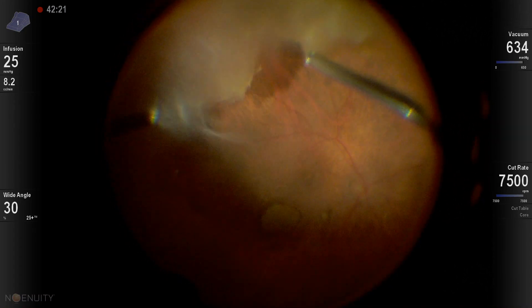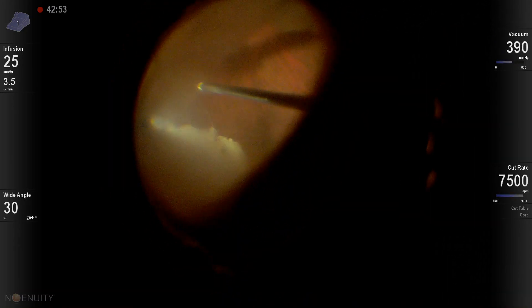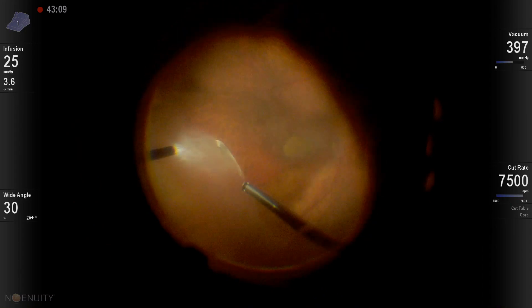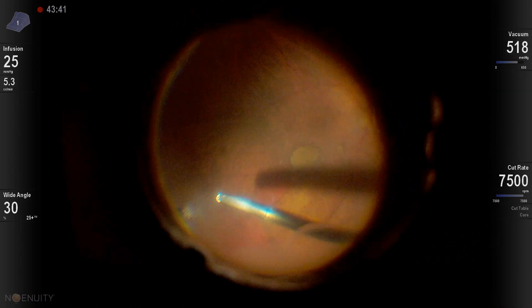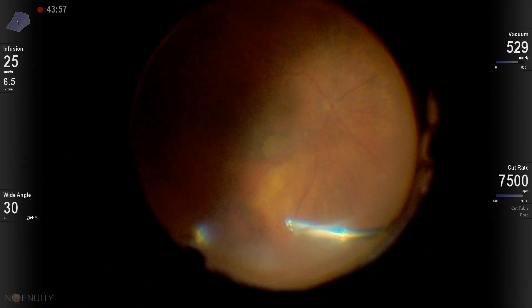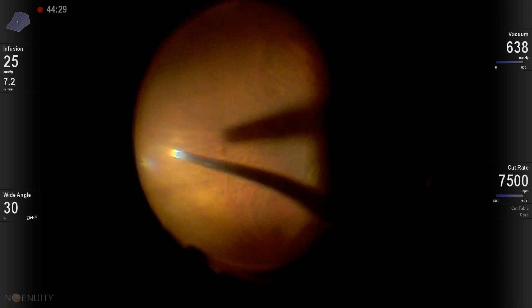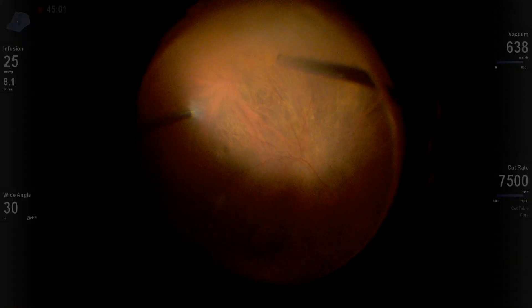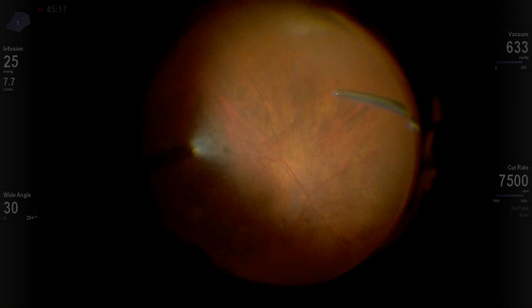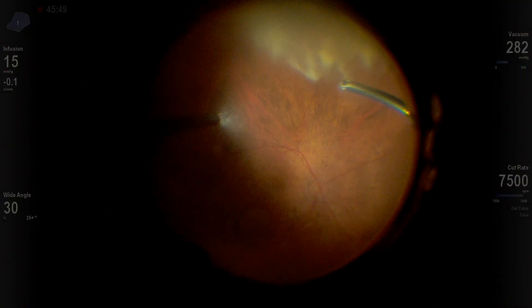I'm showing how to continue the vitreous hemorrhage removal. In general, we're not very aggressive. We indent inferiorly to remove hemorrhage that is attached to the ora serrata inferiorly, because that can be a source of leaching and early post-operative vitreous cavity hemorrhage. But in general, we try not to be aggressive removing the vitreous, especially since there's no peripheral retinal pathology.